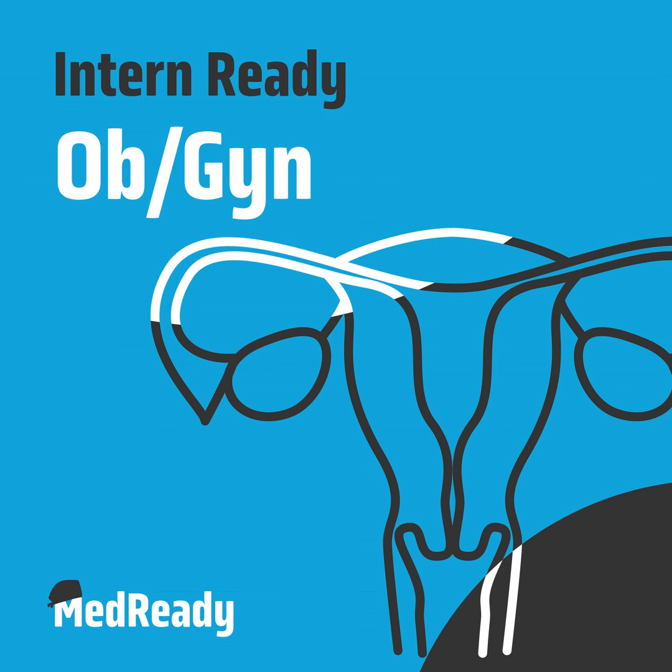And then we touched on this a little bit with fluid management, but fluid overload is really that unique consideration in a hysteroscopy. And so you're always keeping an eye out on your maximum deficit, thinking about what comorbidities your patient has. You'll always notice your attending or senior ask the anesthesia team, what is our patient's mean arterial pressure? What's our patient's MAP?